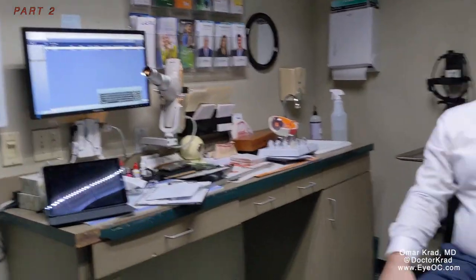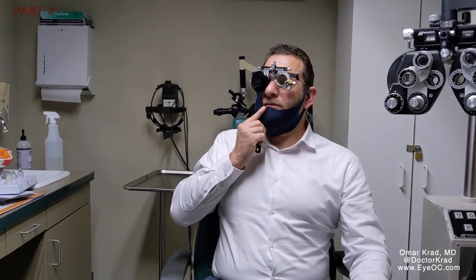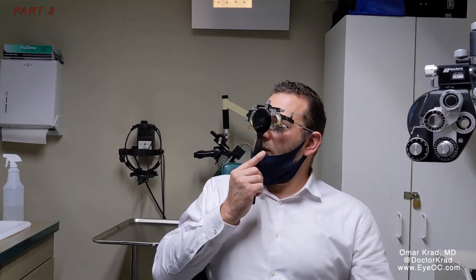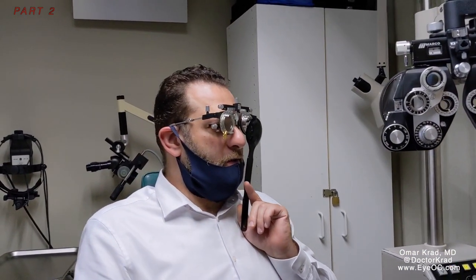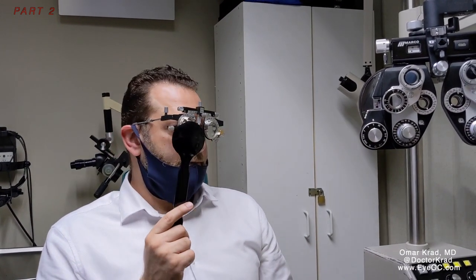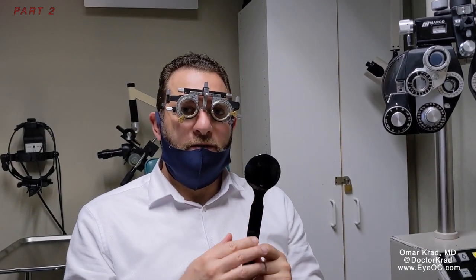Now overall, in just the room setting like this, looking at me, looking over at the wall — compare your two eyes, go back and forth. Looking far, the right is definitely better. Looking at something closer, the left is better. So you like distance a little more on the right, and closer on the left is better. And we said nighttime is better on the left.